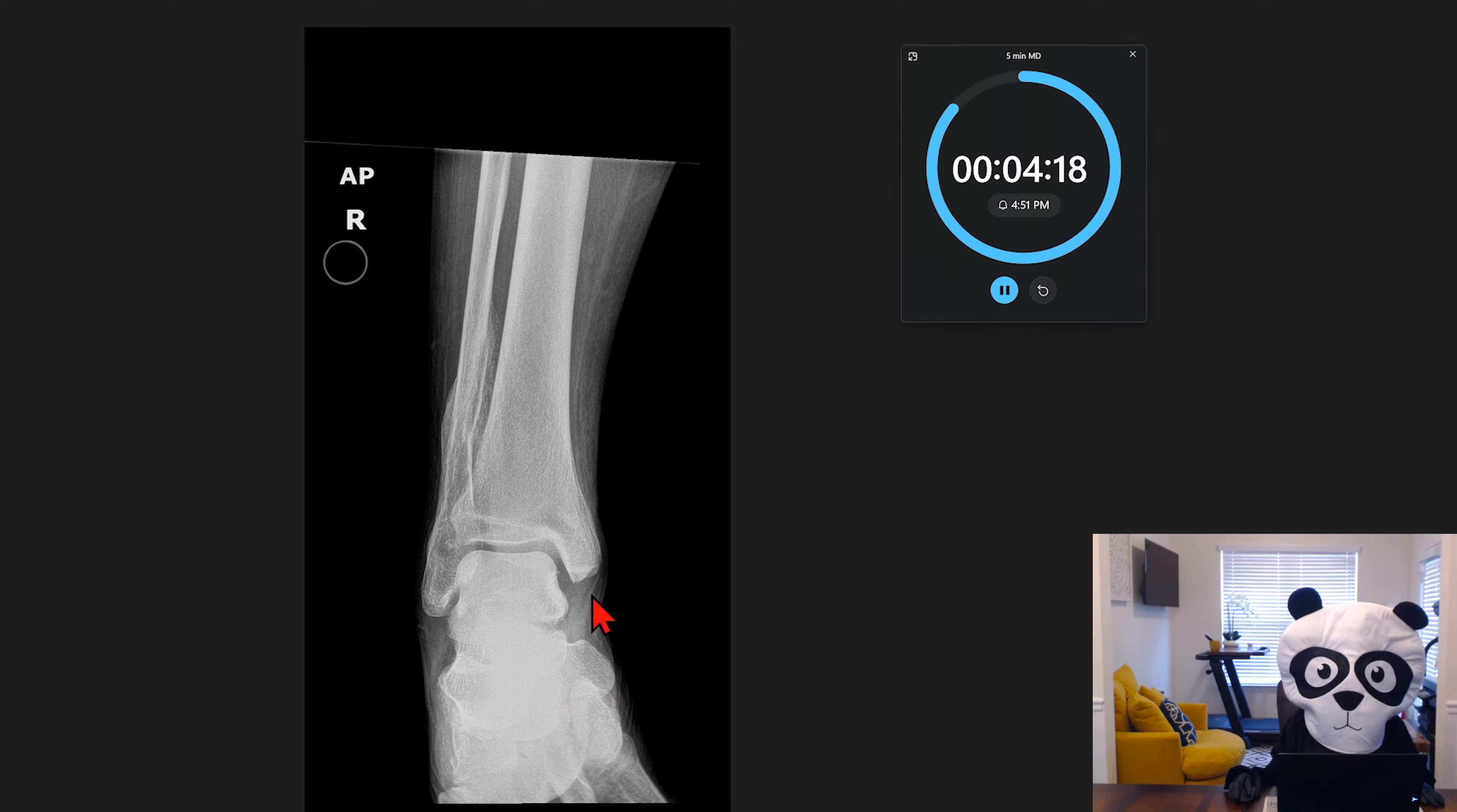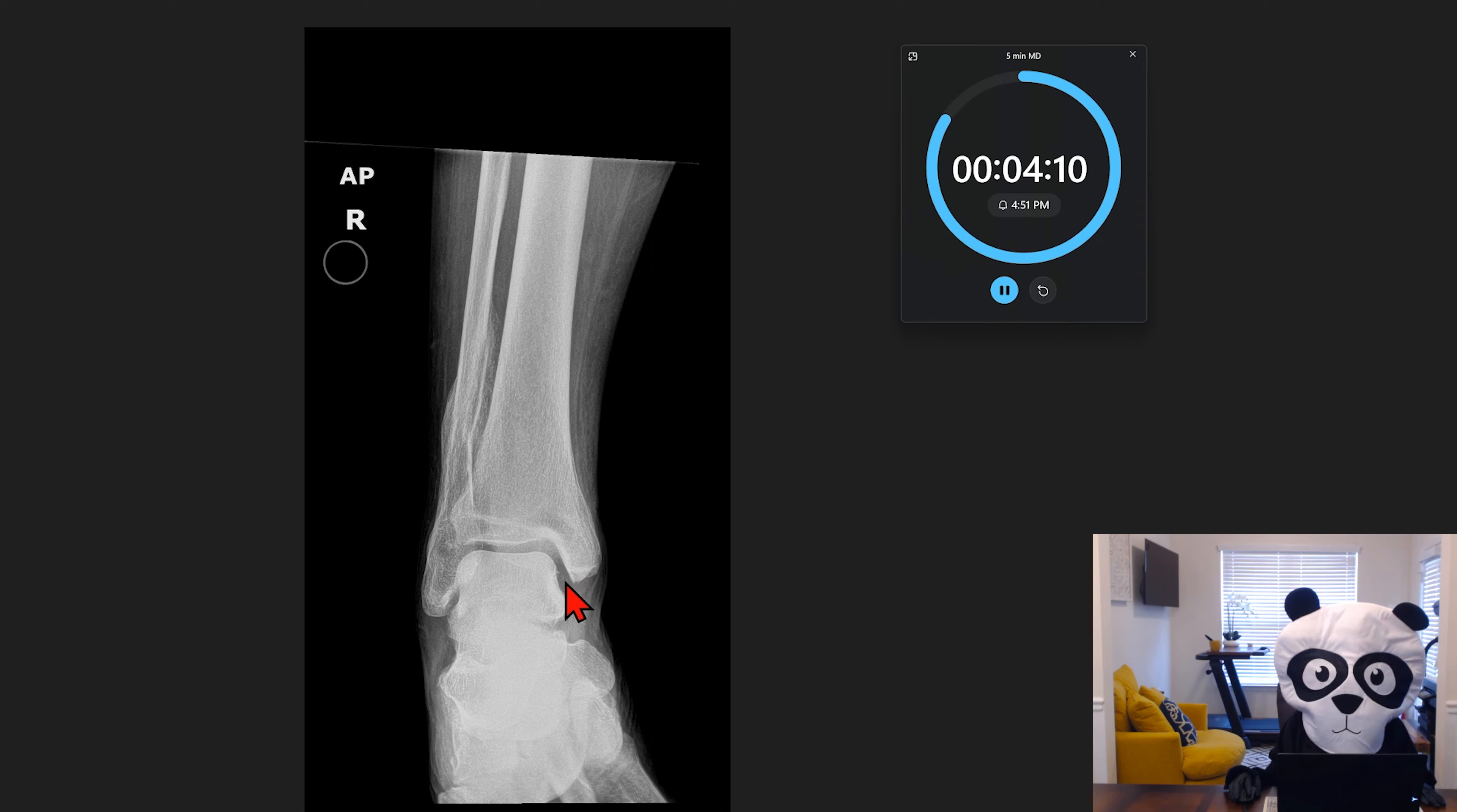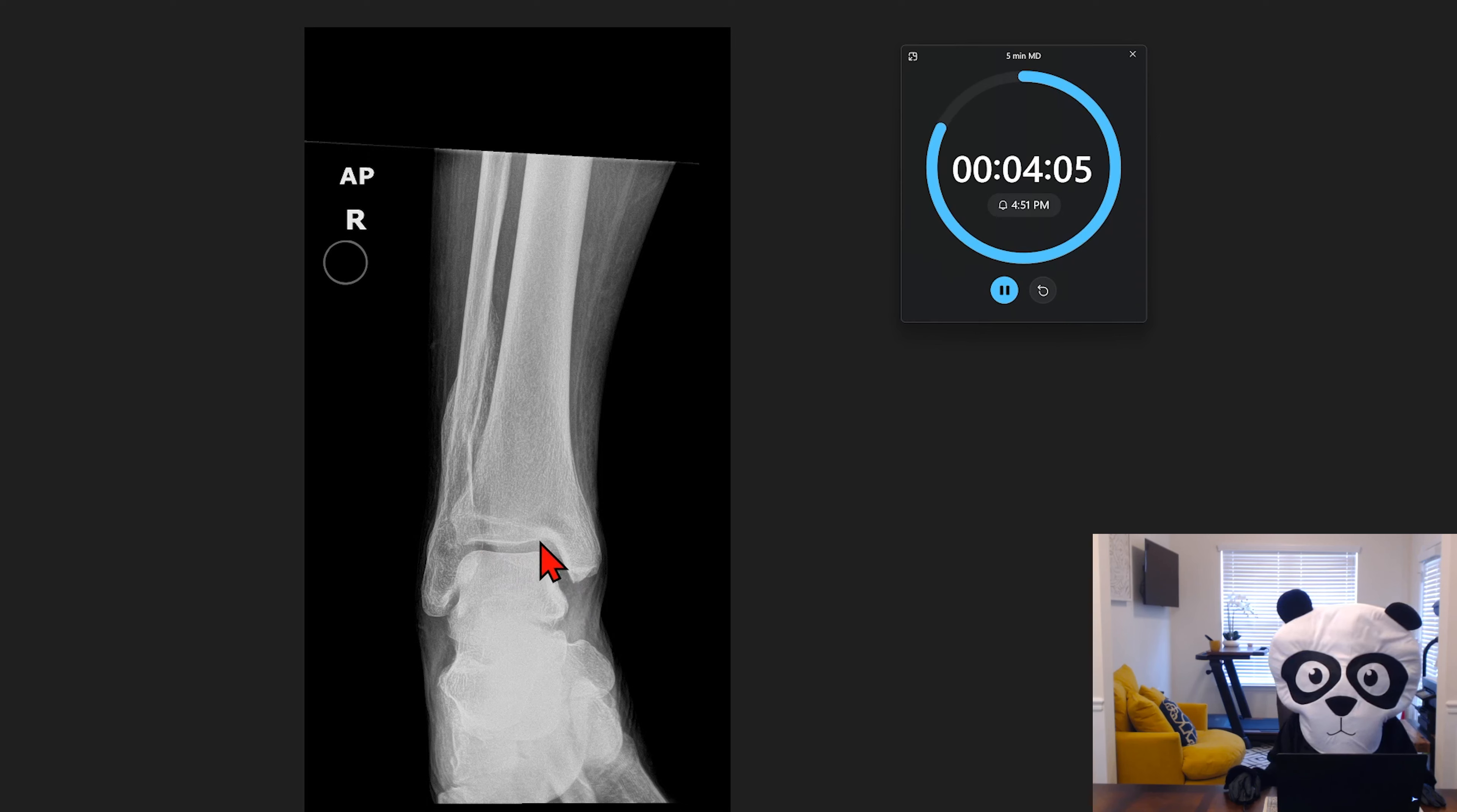So looking at the alignment, we can confidently say there's normal alignment. All of the joints appear to be approximated with normal joint spaces. We don't see any discrete lucencies suggesting an acute or sub-acute post-traumatic deformity.